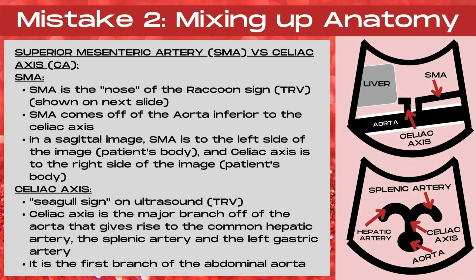The celiac axis is also known as the seagull sign on ultrasound when in a transverse plane. The celiac axis is the first major branch off of the abdominal aorta, and it's going to give rise to three branches: the common hepatic artery, the splenic artery, and the left gastric artery. The left gastric artery is challenging to visualize on ultrasound, so the wings of the seagull sign are going to be the hepatic artery and the splenic artery. In the top image, the celiac axis is the first major branch of the abdominal aorta seen below the liver, and the SMA is the second branch, inferior to the celiac axis.